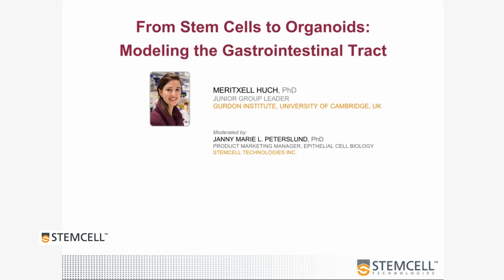Okay, thank you. And then, have you ever tried to use organoids for bacterial infection models? Yes, that's a very interesting question. Recently, a colleague in Hans Clevers' lab developed a human stomach organoid culture, and we did these experiments together, infecting Helicobacter pylori into these stomach cultures.